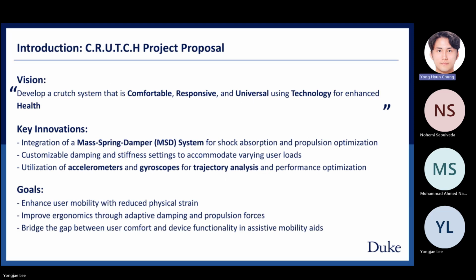Our project stands for Comfortable, Responsive, Universal Technology for Crutch Health. The aim is to address the shortcomings of current crutch designs by integrating a mass spring damper system to improve shock absorption, energy transfer, and user comfort.